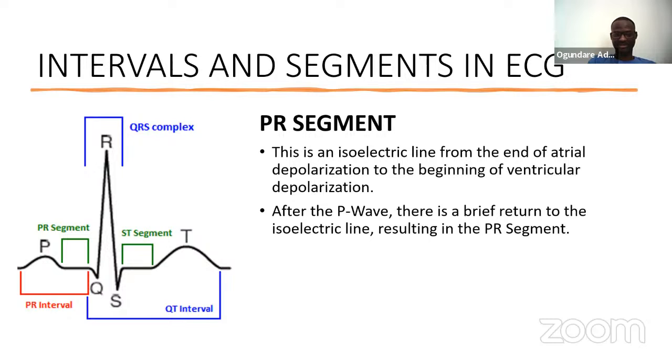You can see it just after the P wave and before the Q wave. And that is what we are talking about, and I've just given us a bit of a tip. A depressed PR is usually seen in pericarditis alongside the widespread ST elevation.